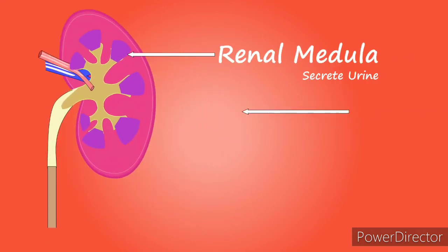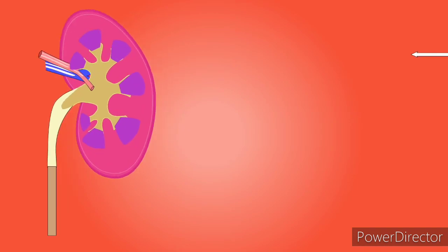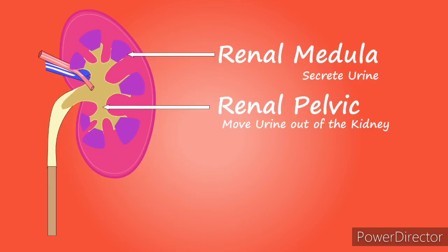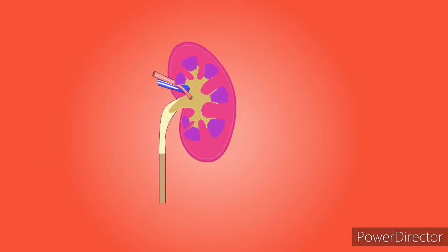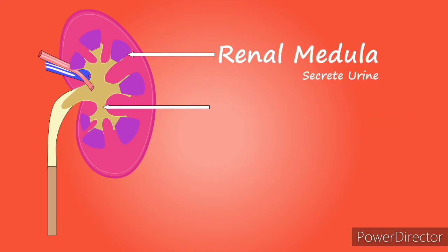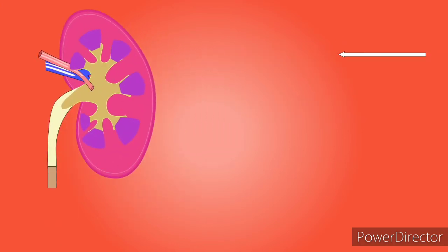When it comes to chemical analysis, you have to check for the pH of the urine, glucose, protein, if there is blood in that urine, ketones, bilirubin and urobilinogen. Then if you are viewing the urine sample under the microscope, there are some things you need to check out for.